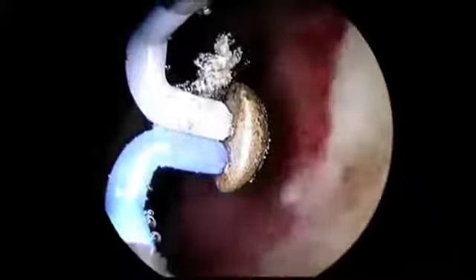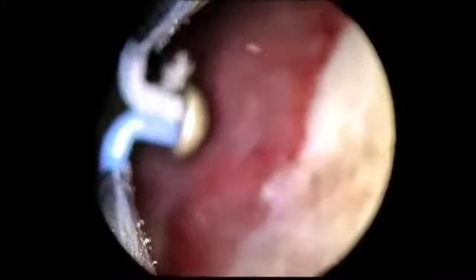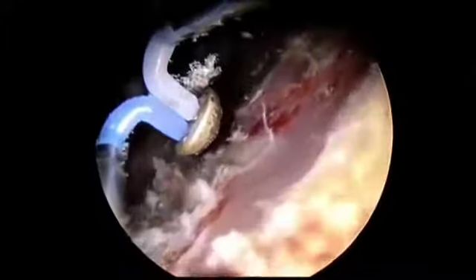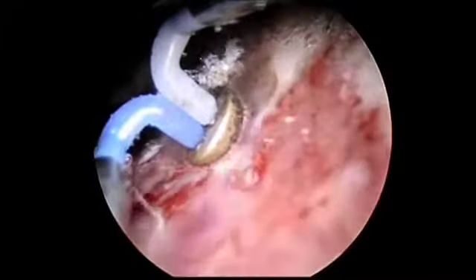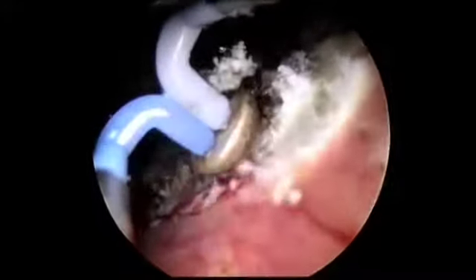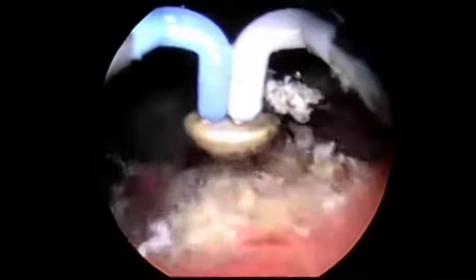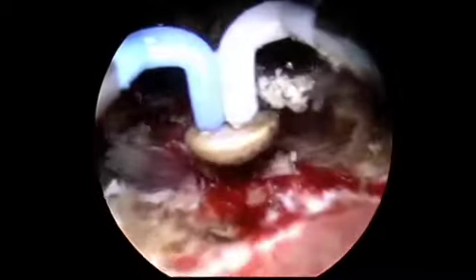We then use the bipolar electrode to obtain hemostasis in the usual manner. The configuration of the button is much more efficient at achieving hemostasis and at reaching the edges of the tumor resection as compared to a right angle loop electrode.